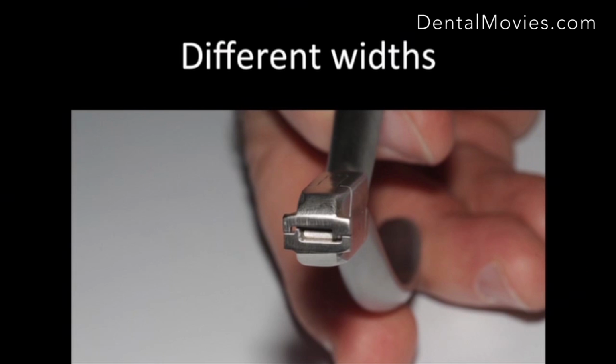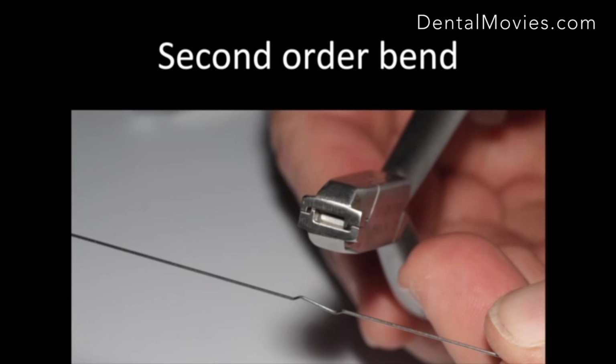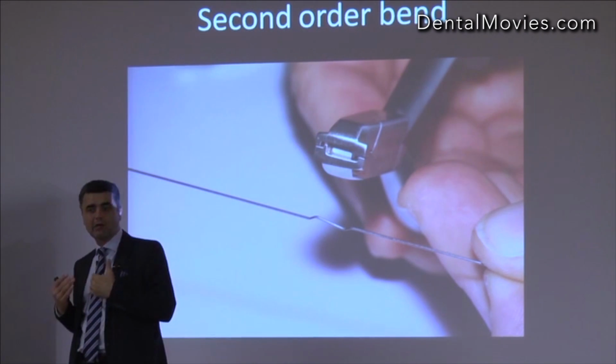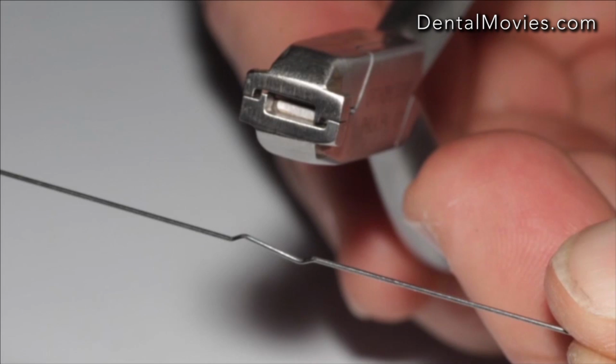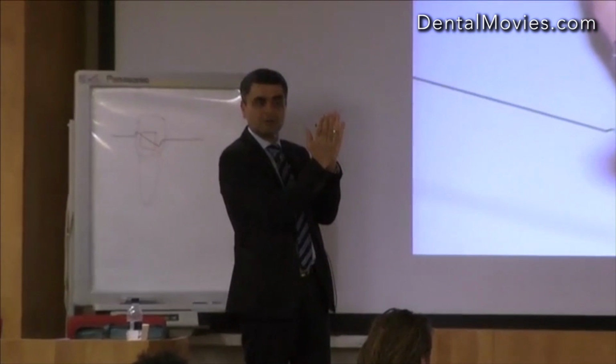So if you look at this plier, it's a bracket width, can you see? And if you get that plier and you press, bingo, your bend occurs for you. And the low side is the side that the crown is going to move to. Or the high side is where the root's going to move. So when do I use this? On my Panorex, when I see roots are together like that. Yes? You got it?